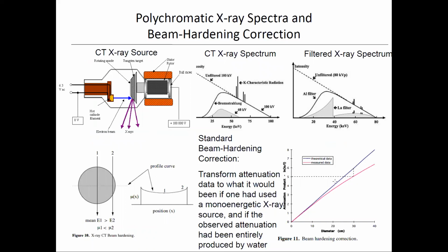So your polychromatic source arises from the way that you make the X-rays, which the challenge with the X-ray source is all the power, because you're making a lot of X-rays. That's what you're trying to do, and traditionally, before you were dose conscious, yeah, you made it as powerful as you could. Makes for faster exams and whatnot. But okay, you still can use a hefty source, but let's just say that your source can easily melt the target if you don't design it right.